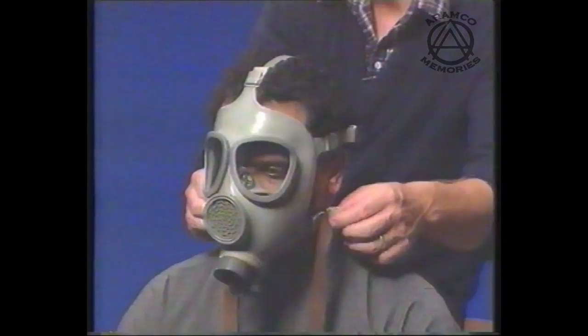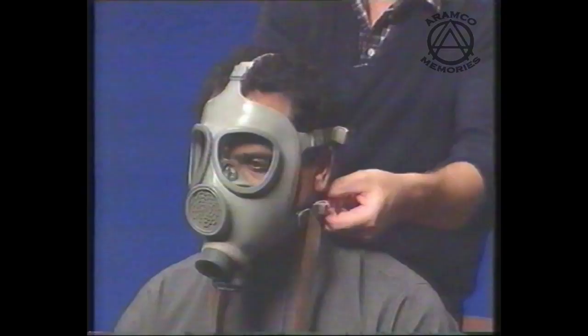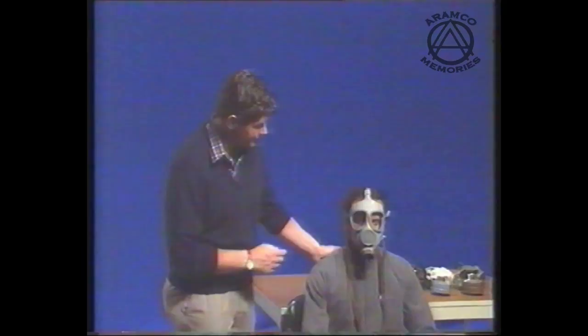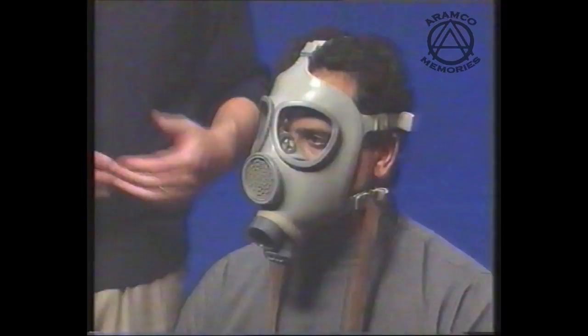You then ask the person fitting to lean forward gradually, and as he leans forward you pull gently on the tabs. Similarly with the centre straps — check that they are only finger-tight. Ask the person, do they hurt? We are now ready to carry out the confidence test. I will explain what is going to happen — I am going to place my hand over your inlet valve and ask you to breathe in. When you breathe in, I hope that the face piece will collapse on your face. Breathe in please. The face piece collapsed on the face, confirming an air seal.